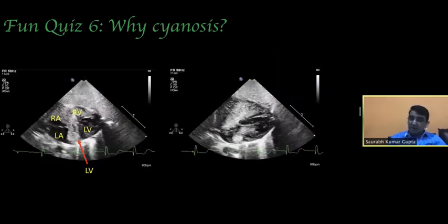Now then we did saline contrast echocardiography. Now this is actually not a fun quiz, but I guess by listening for almost half an hour into this talk, you would be able to make an intelligent guess as to what is happening in this case.